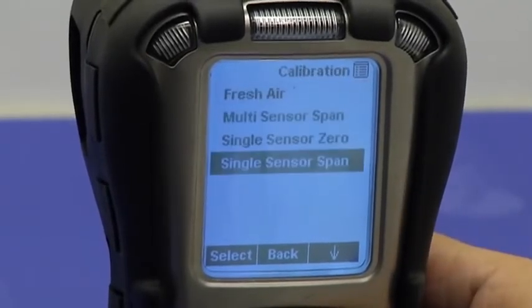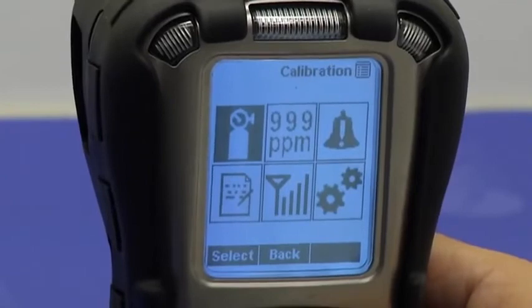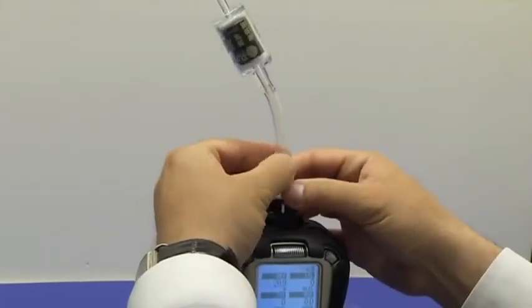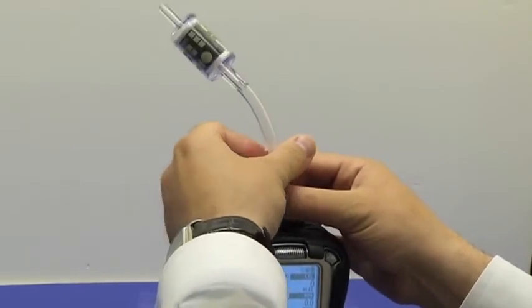Press the mode button to return to the main measurement screen. And as always, remove the charcoal filter prior to using the instrument.